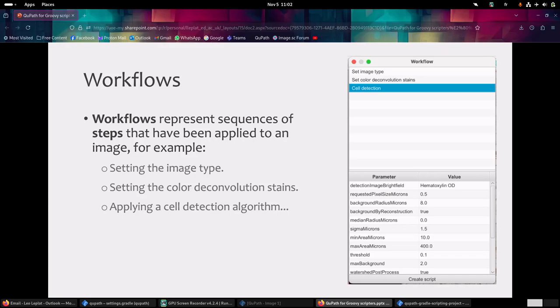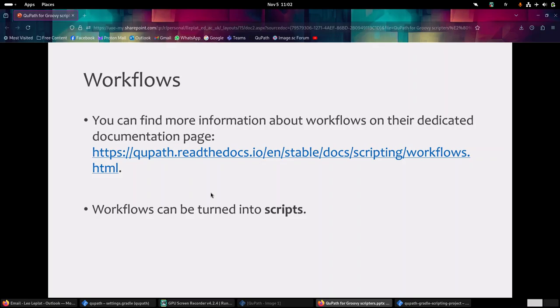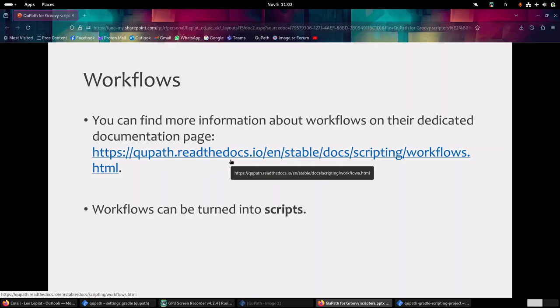Before actually going into scripts, I want to mention workflows. In QuPath, when you do some analysis, the software will automatically record most of what you do through a workflow. A workflow is a sequence of steps that have been applied to an image - for example, setting the image type or applying some cell detection algorithm. I don't want to spend a lot of time on this because the documentation is enough to explain what a workflow is and how to use it.